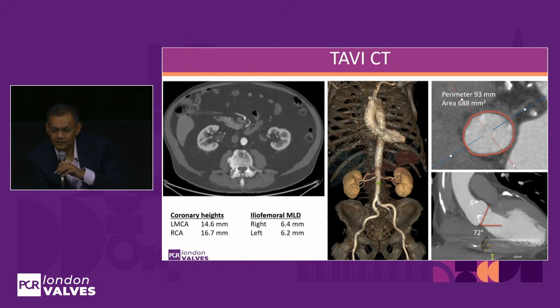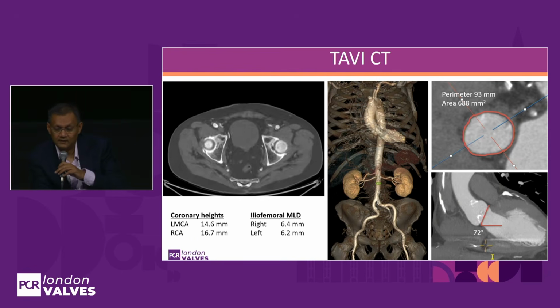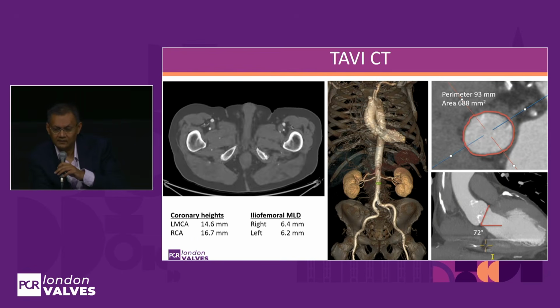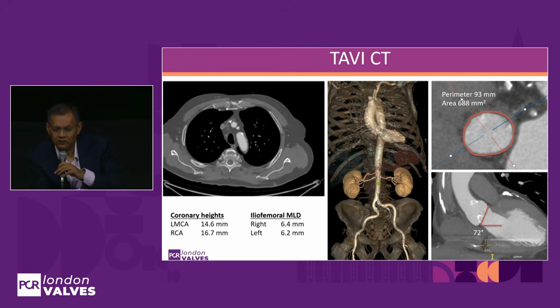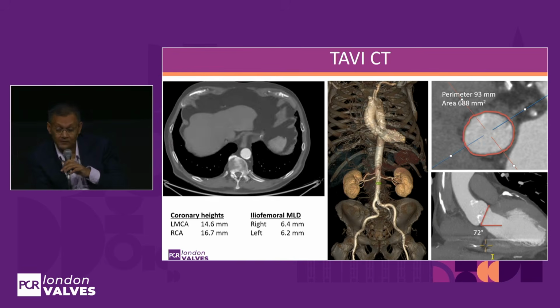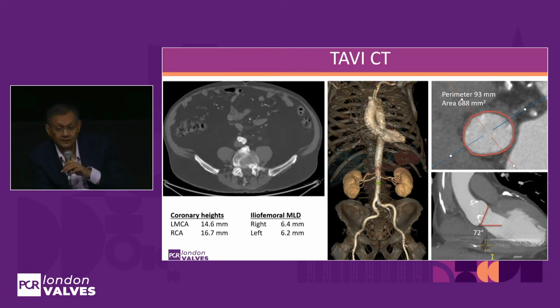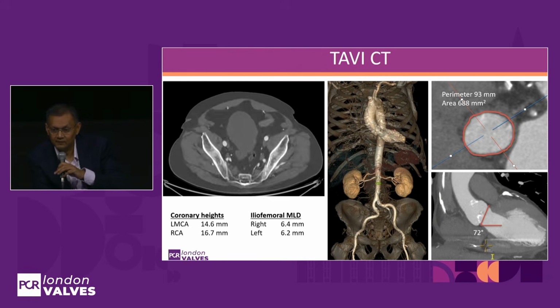And with the horizontal aorta, that may be well. The other important thing is that in the context of potential LV dysfunction, you often need very slow, if any, pacing, and the degree of hemodynamic compromise is very limited as well. So I think that would be a pretty good option.